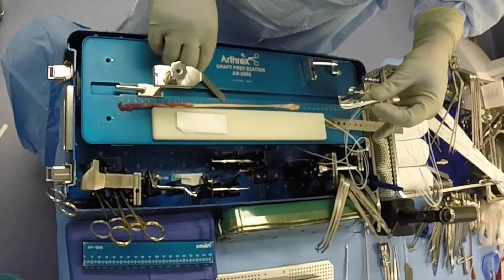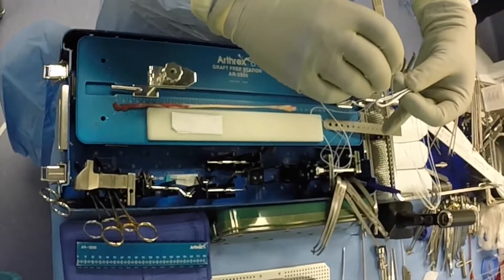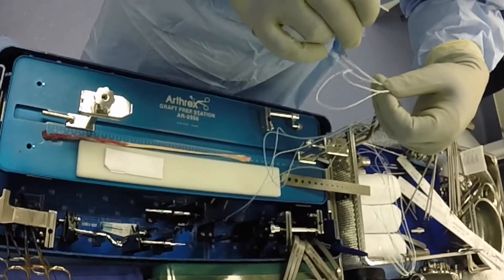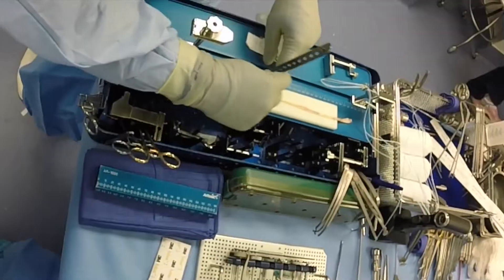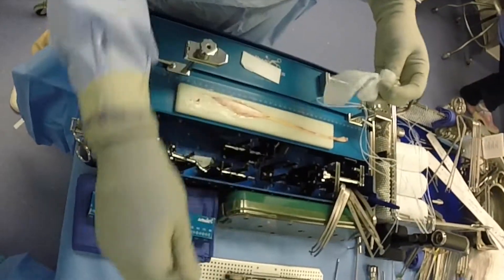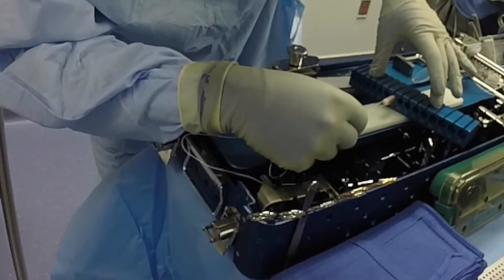A second TightRope is then lengthened, and this will be for our tibial side. Our semitendinosus autograft is then stripped of any muscle and then sized.